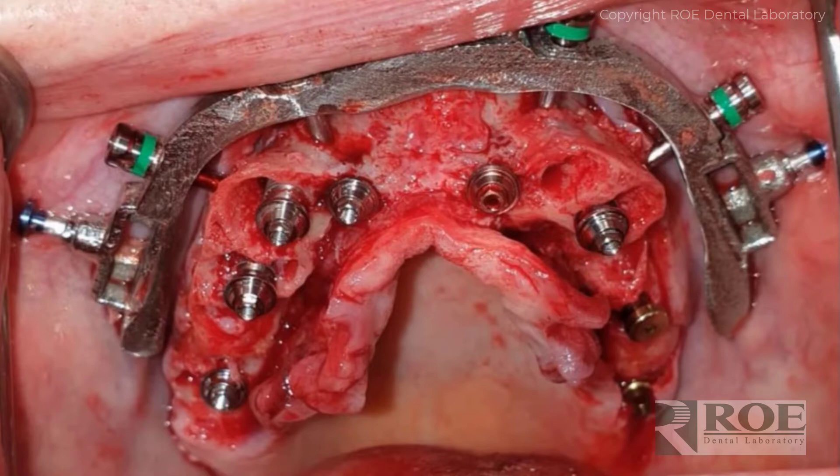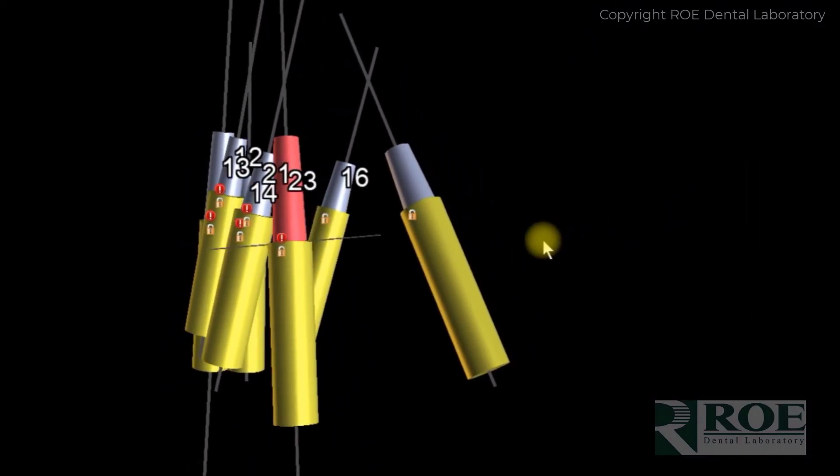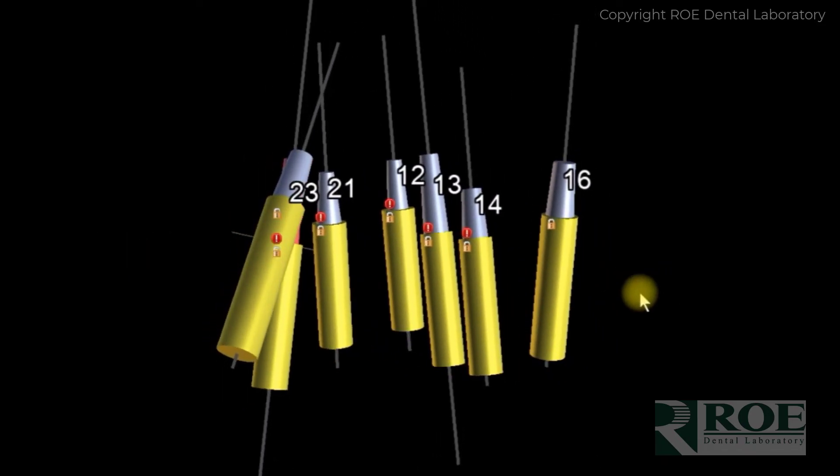The site is prepared, the osteotomy guide goes in, the sites are drilled, implants are placed, and abutments are placed. At this point, unlike other Chrome cases, there is no carrier guide — the prosthetic goes directly to the fixation base. The doctor places temporary cylinders. On a natural case the doctor is fortunate because these are all straight implants, which makes restoring the case fairly simple.